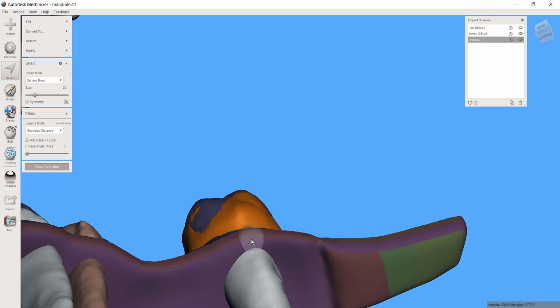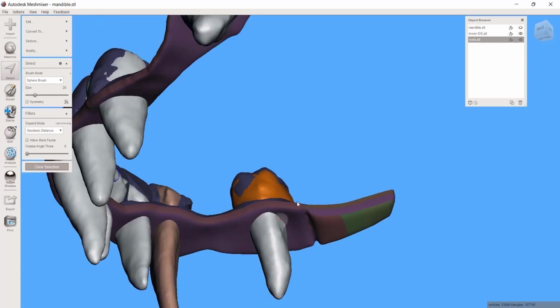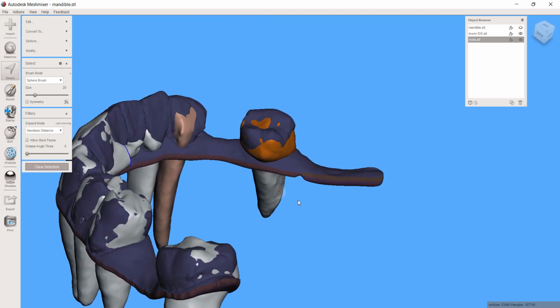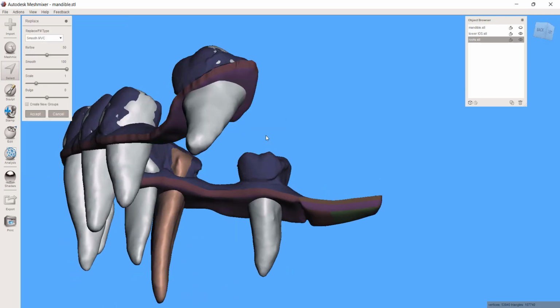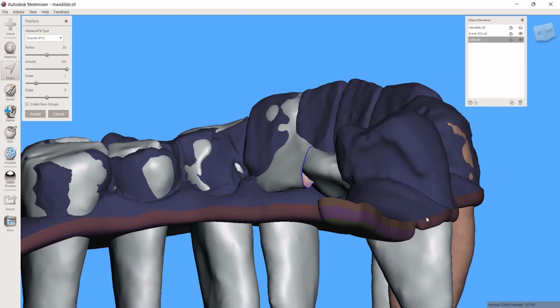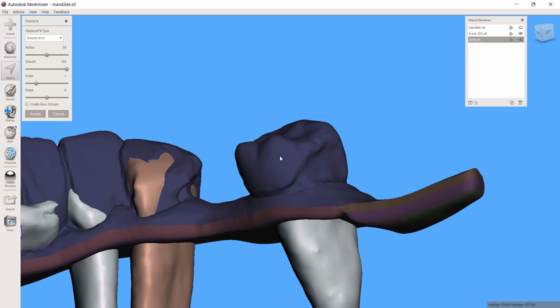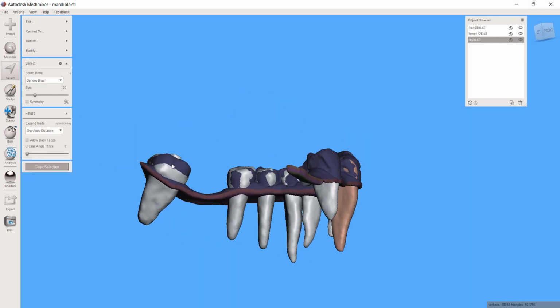If you were, like let's say if I extend it here, hold shift on your keyboard, and now your select tool becomes erase. And I could delete that and repair it, or I could maybe even hit F. F is erase and fill. Okay, and I'm just looking to see that I no longer have any portion of the segmentation sticking through into the crown. So that works. You could do that one by one on all these teeth.